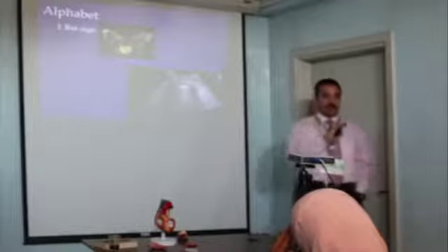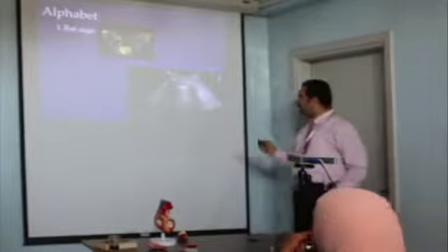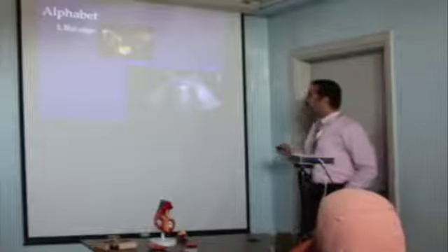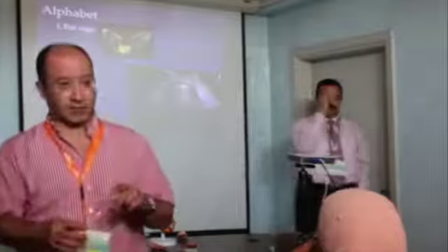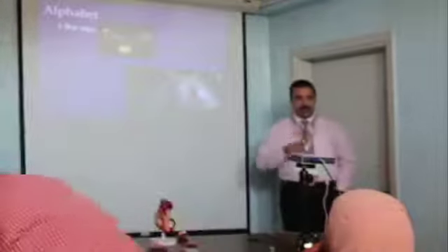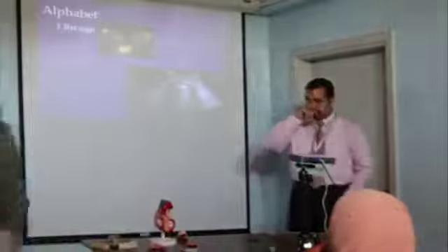These are the landmarks I'm starting with. You will see this in each patient. If you don't find it, just try to move your probe up and down until you get two ribs and lung tissue in between. This is the starting point, and we will do that in practice handling.